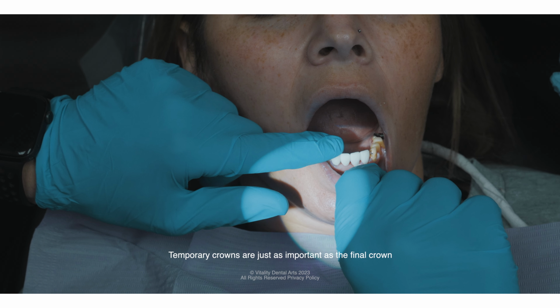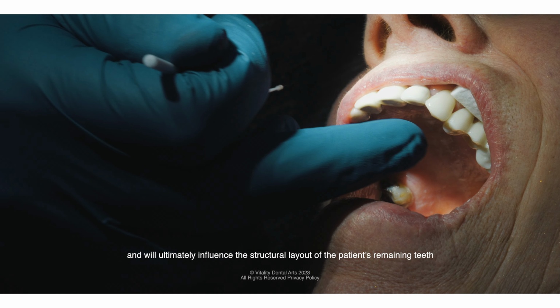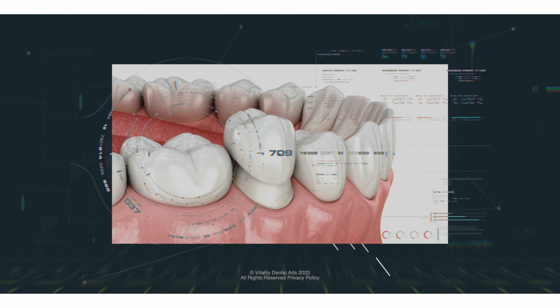Temporary crowns are just as important as the final crown and will ultimately influence the structural layout of the patient's remaining teeth, hence affecting the final fit of the crown.